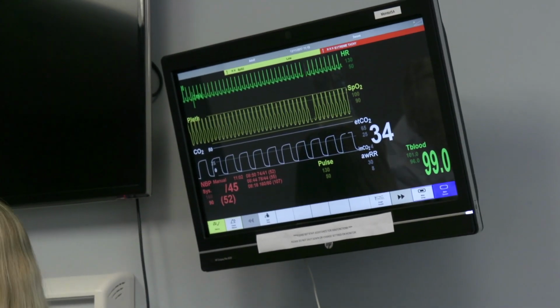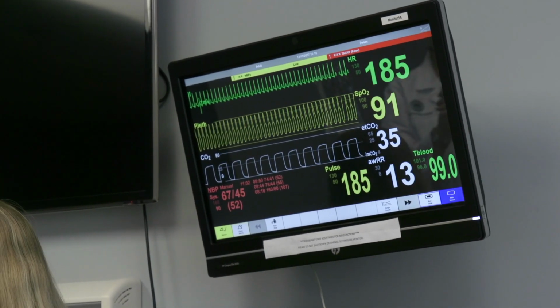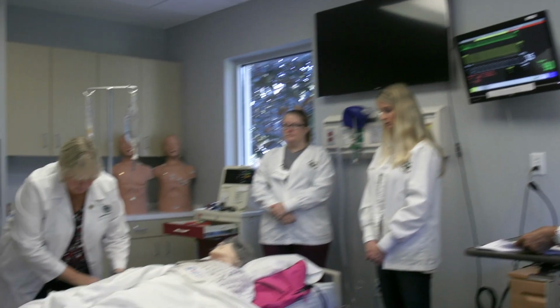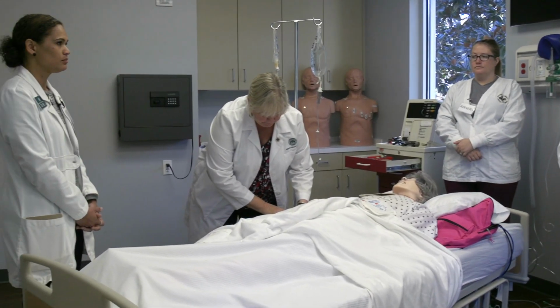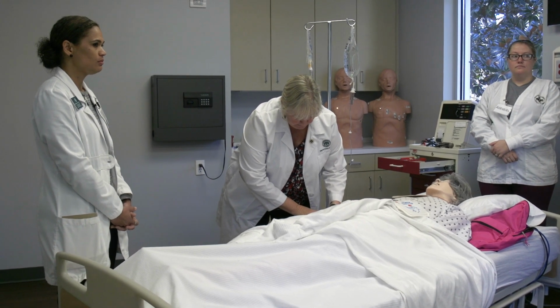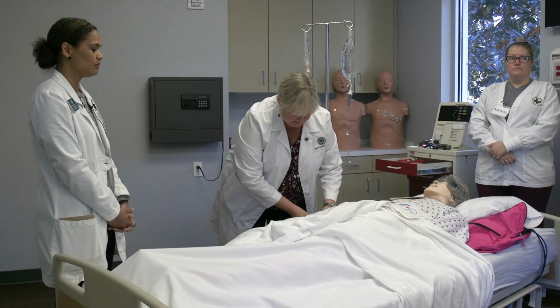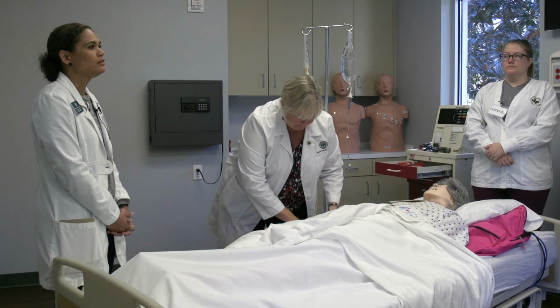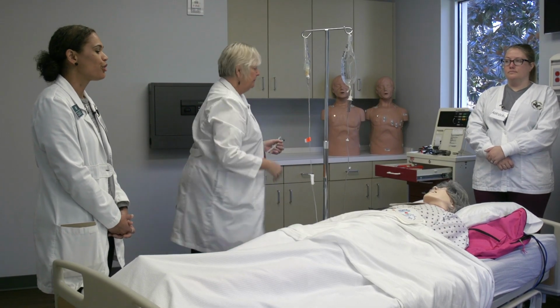What I'd like to do is repeat the adenosine and do adenosine 12 milligrams this time, IV push, followed by a rapid saline bolus. 12 milligrams adenosine in. There was a little pause after the adenosine, followed by a 20 cc flush, but she's still right back up to that rapid rate. So at this point, the adenosine did not work, so I'd like to do synchronized cardioversion.